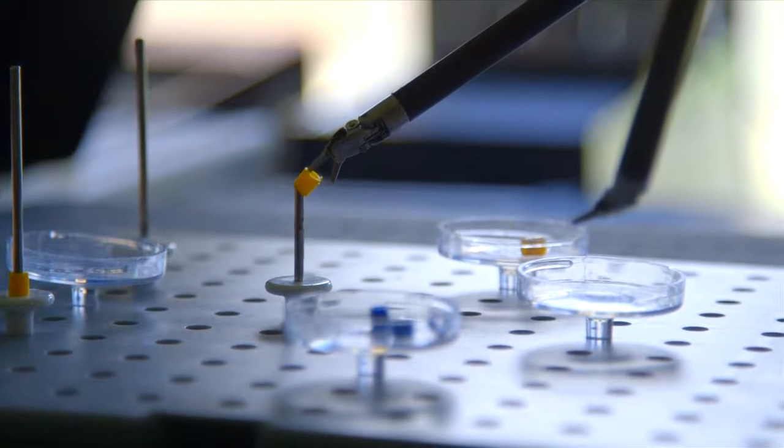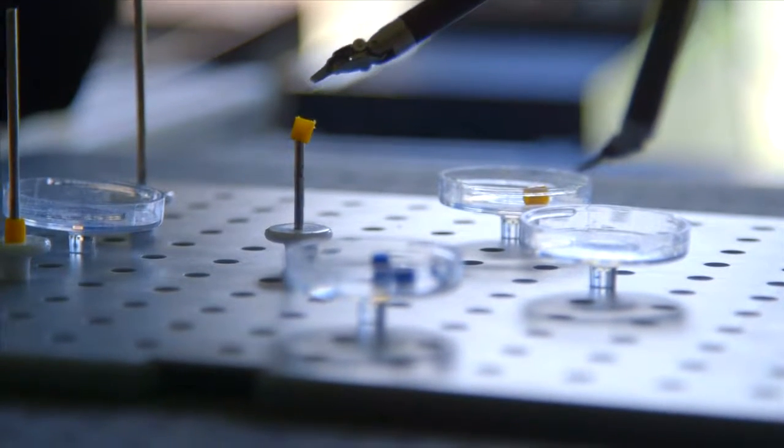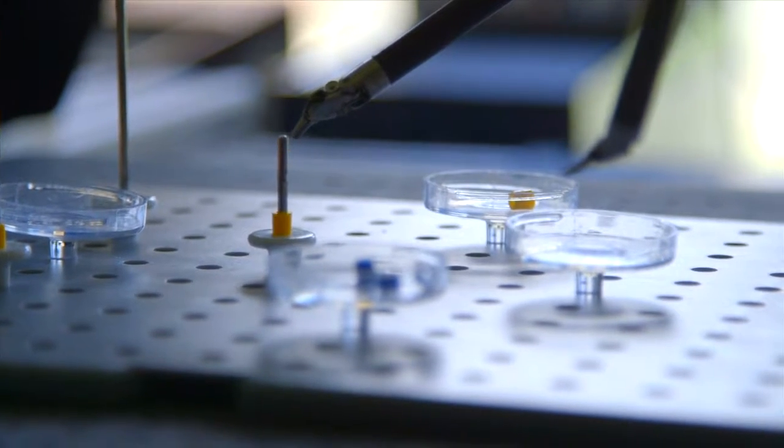simulation as well as a physical testing environment where surgical trainees as well as potentially surgical attendings can improve on their skills. The benefit of using robotic surgery actually accrues from using minimally invasive surgery techniques. So you now have a thin, long, pencil-like instrument that you introduce through a very small hole within a person's abdomen. And it lets you perform the procedure, and in terms of healing, you just put a single suture at the place where you enter, and the patient can go home literally in under 23 hours.